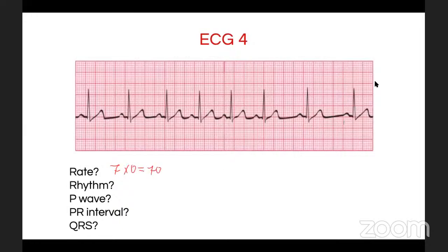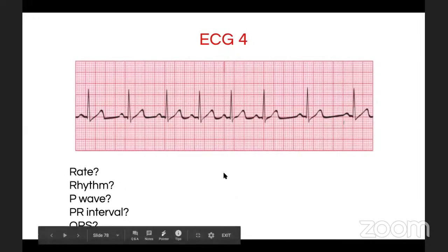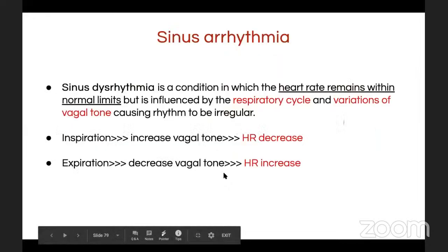وقلنا irregular rhythm، المشكلة هنا irregular. طيب والبي ويف هل هي موجودة قبل كل QRS؟ موجودة صح؟ موجودة. طيب البي ار انترفل نحسبها. نشوفها 1 2 3 4 تقريبا it's normal yes. والكيو ار اس تقريبا 2 boxes which is normal. اوكي اوكي next one. اوكي هذه sinus arrhythmia.